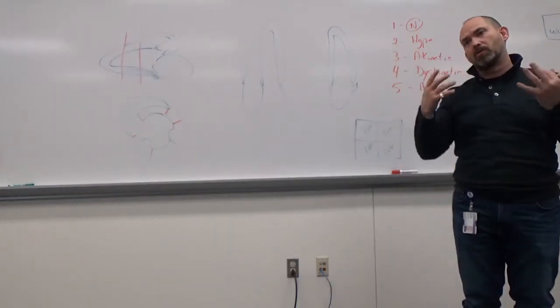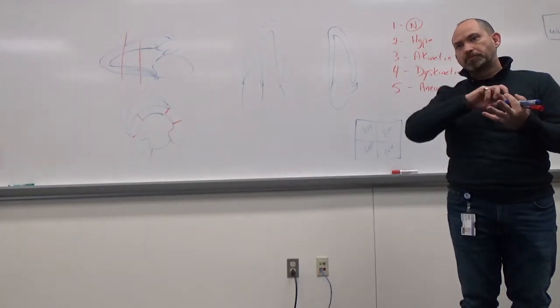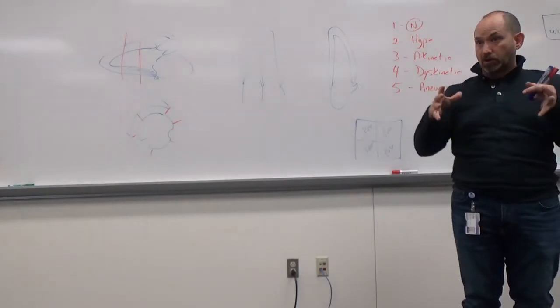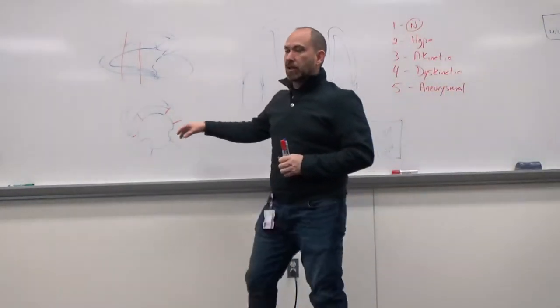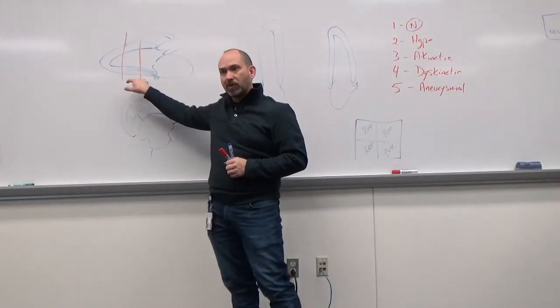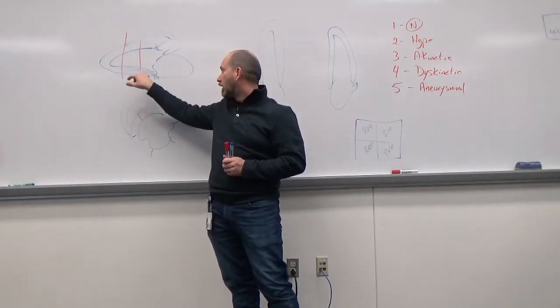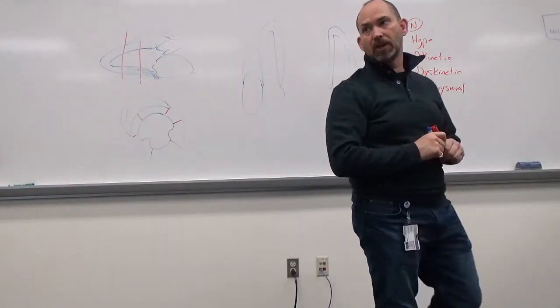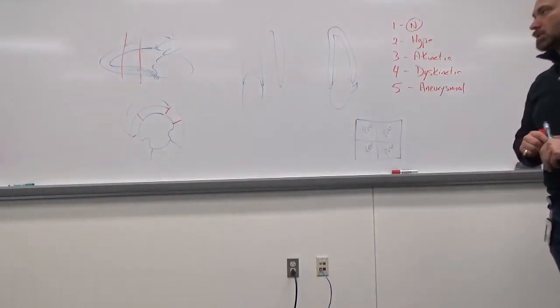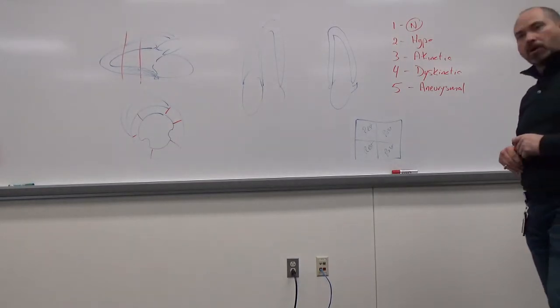We want to see that when we've reperfused it, we're not going to be able to revive dead tissue, but the surrounding areas are now contracting the way they should. Often what you're going to get is a compensatory contraction on the other side. So this wall's out and having issues, this wall's typically going to squeeze harder and stronger to compensate for that area. So we're looking to see that that disease doesn't spread if we're looking at somebody who's had a prior heart attack.